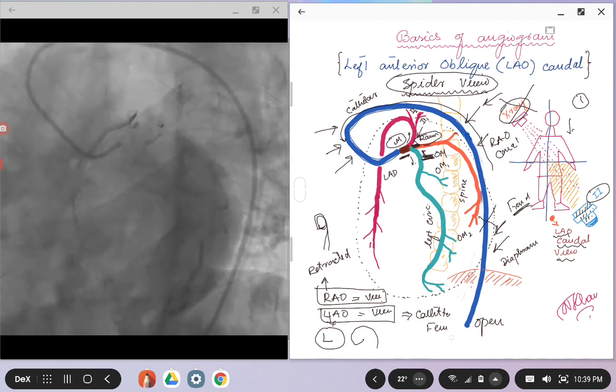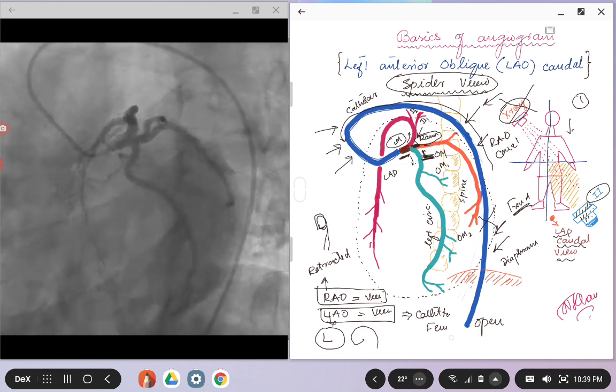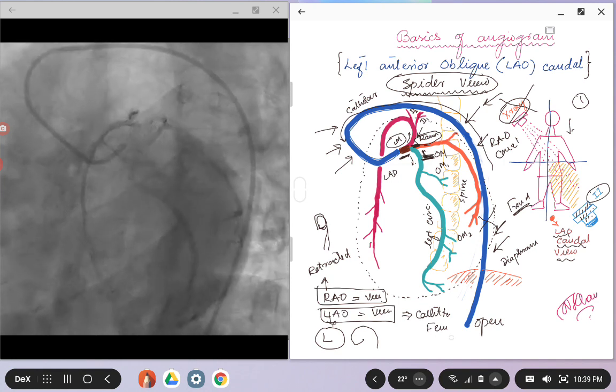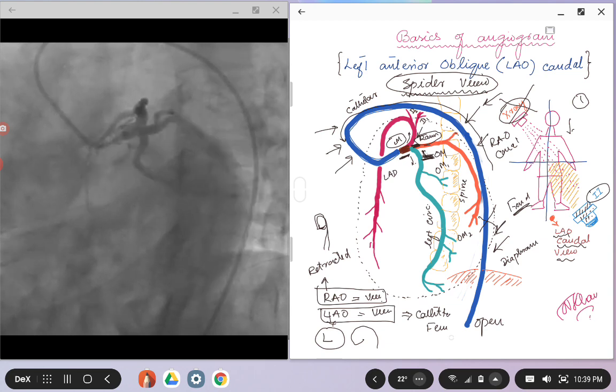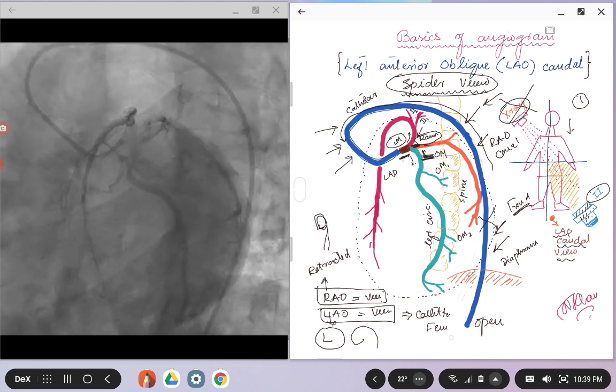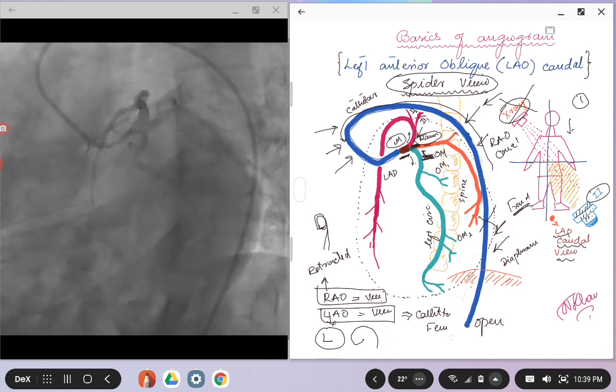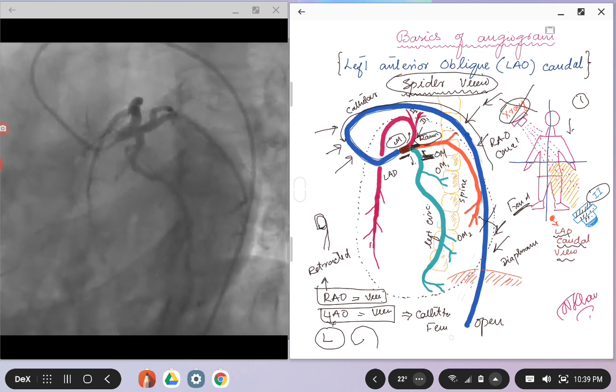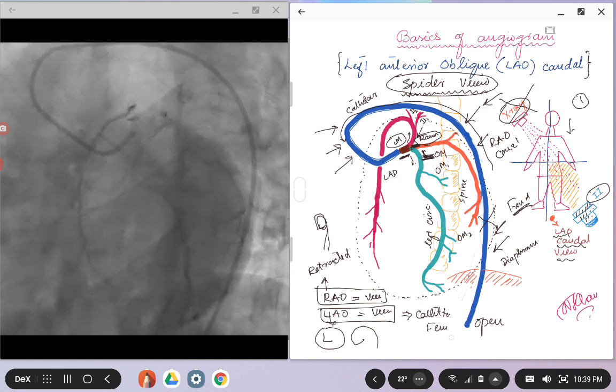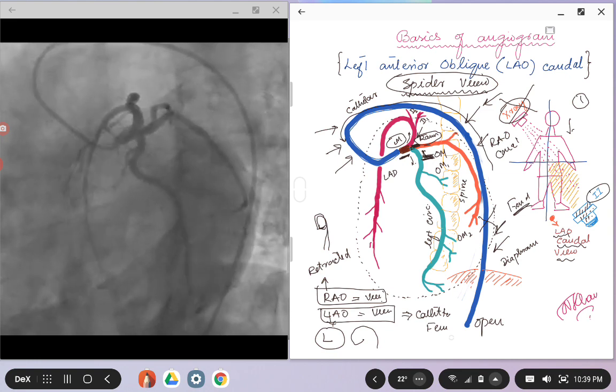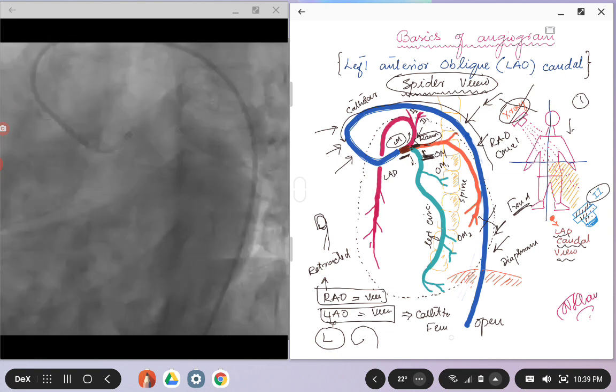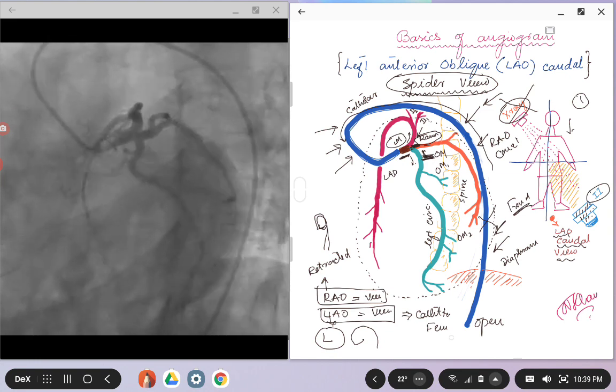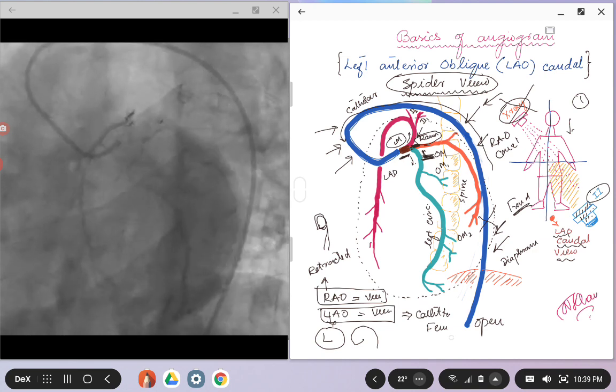Sometimes some people might call this ramus intermedius as a very high OM if they have any hard time recognizing if it is truly coming from this fork here. But in this example, the angiogram I am showing, you can clearly see that there is an artery coming right at that fork, so that constitutes the ramus.